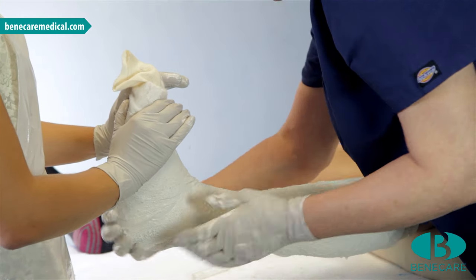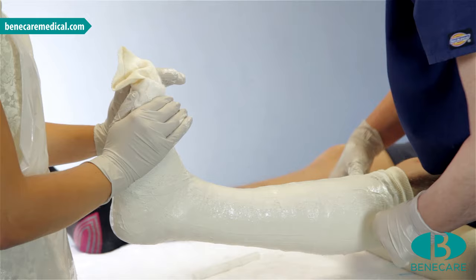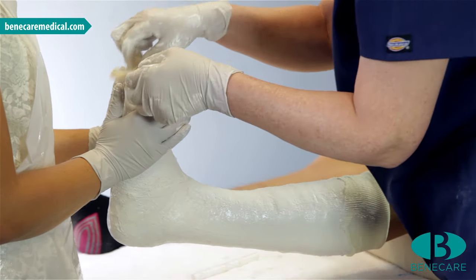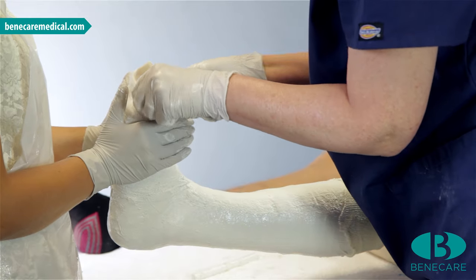Smooth the cast to laminate the layers and ensure the cast is strong and durable. If desired, turn back the ends of the stockinette, of which this should be no longer than 2cm.